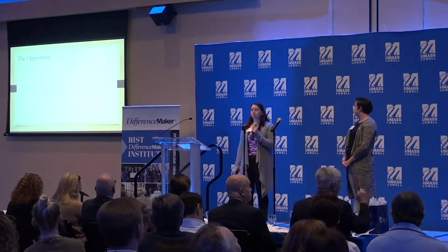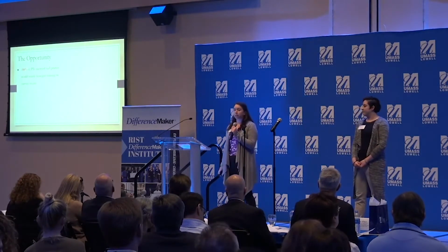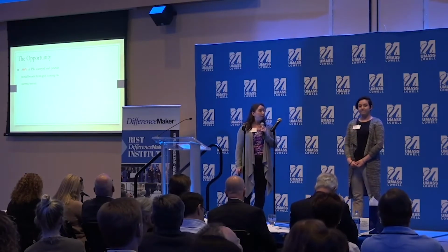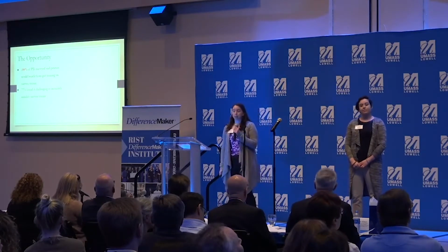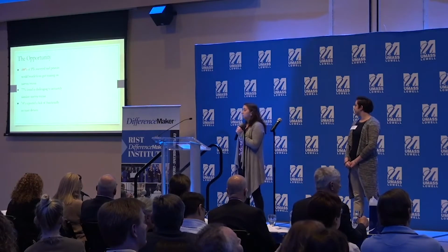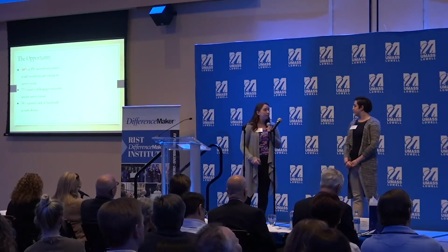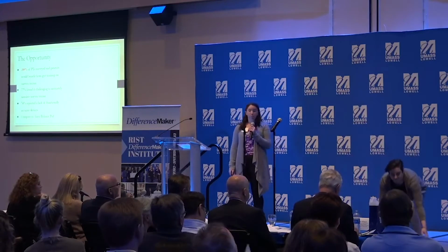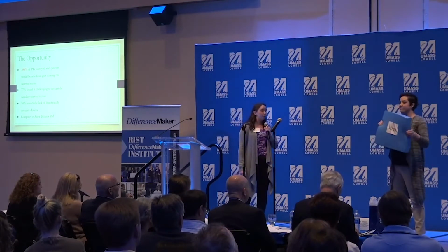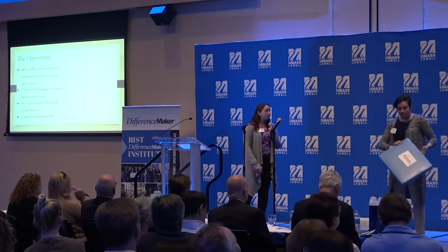We surveyed UMass Lowell PTs and PTs practicing in the surrounding area. 100% responded that patients would benefit from gait training on uneven terrain. However, 77% said they found it challenging to simulate this terrain, and 74% said that was due, in part, to a lack of functionally accurate simulation devices. The AirX Balance Pad is the most comparable product on the market. It is a foam balance pad that cannot simulate an outdoor environment and patients cannot walk on, and is therefore not a solution to this problem.